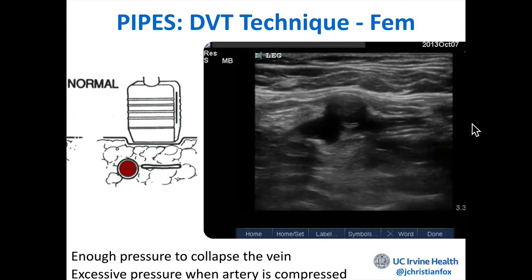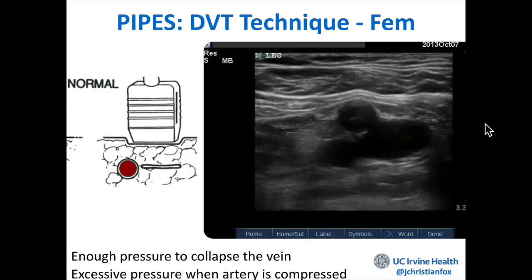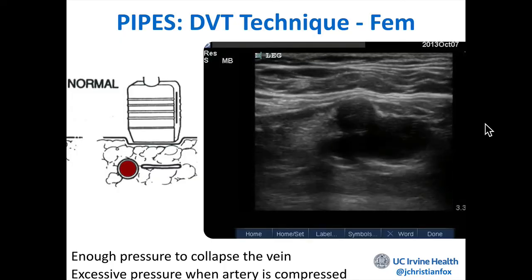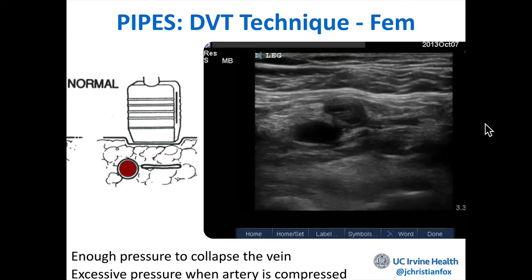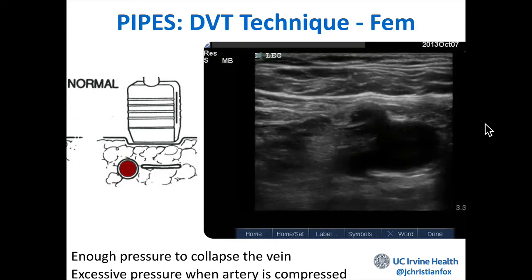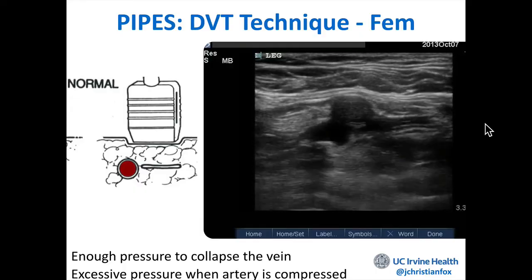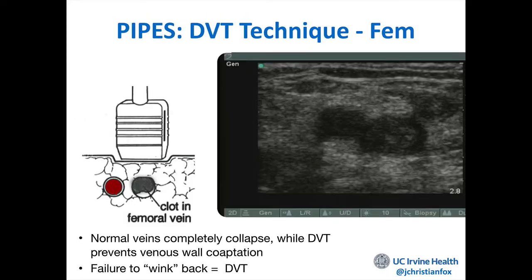And I know that sounds kind of funny, but in the heat of the battle, you'll be upside down trying to do an ultrasound with your left hand, trying to put a central line in someday on some crazy crash code situation, and you'll forget about the other non-vulgar way to remember which is the artery and which is the vein, and you'll remember venous penis.